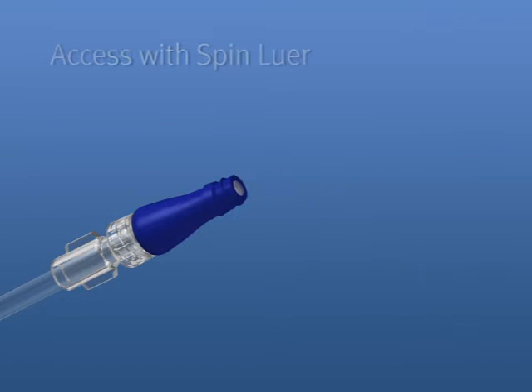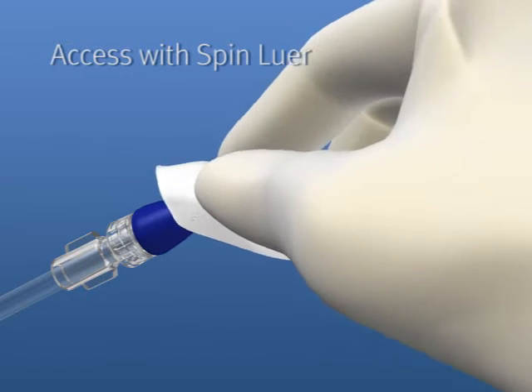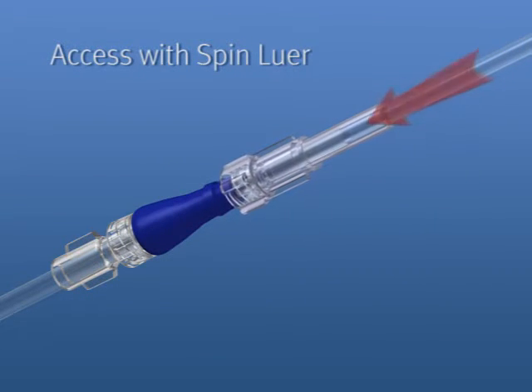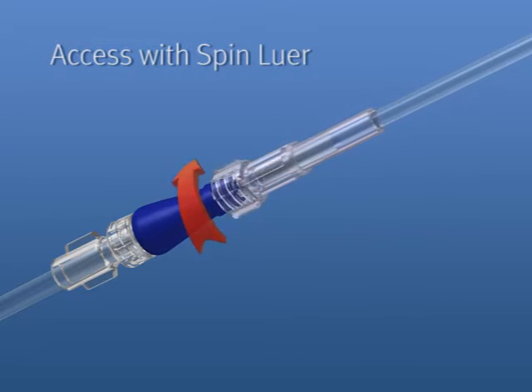To access the Microclave with a spin lure, swab the top of the Microclave with alcohol, then push and twist the lure slip into the Microclave until secure. Twist the rotating collar to lock.